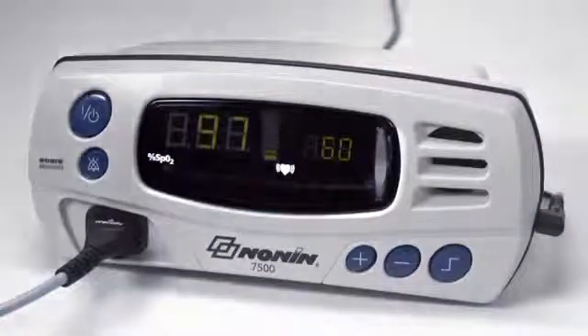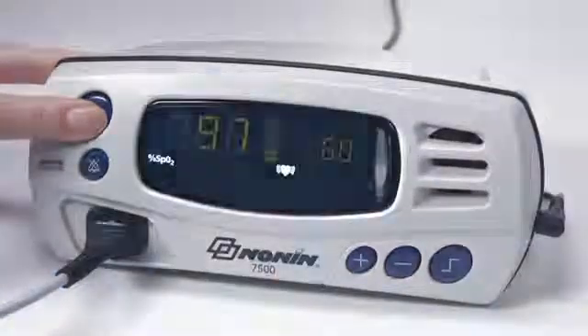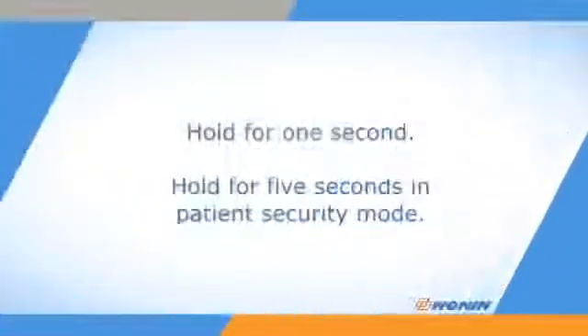When you are ready to stop using the oximeter, simply press and hold the ON-OFF button until the oximeter turns off. Hold for 1 second in normal function and 5 seconds if the oximeter is in patient security mode. Then you can unplug and remove the sensor.